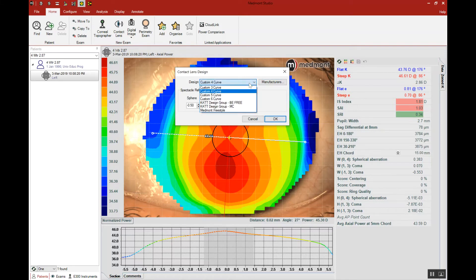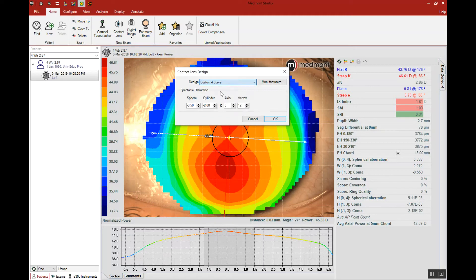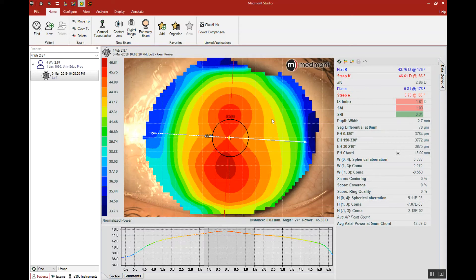In this case, we're going to select a simple custom four-curve design, a multi-curve that we could get from any lab in the world. Notice the Rx has been automatically imported. We'll click OK.